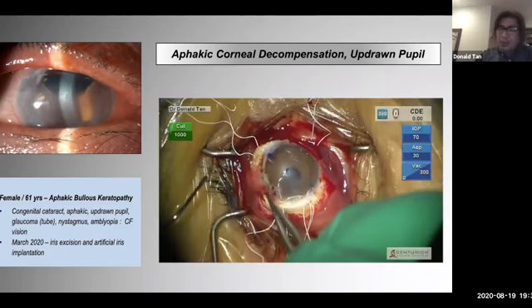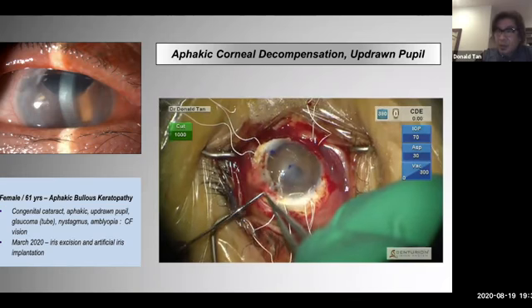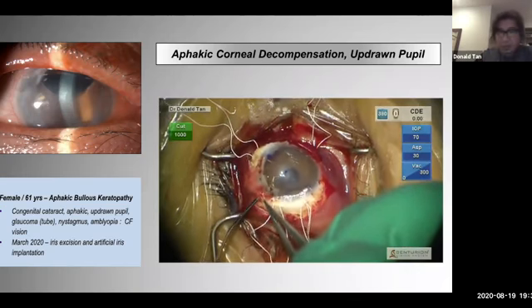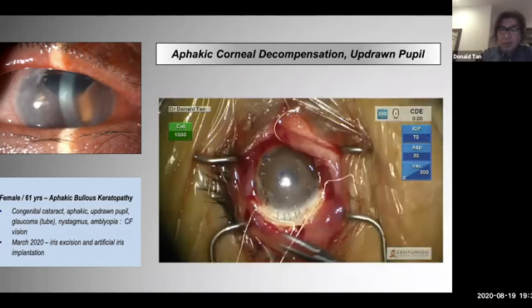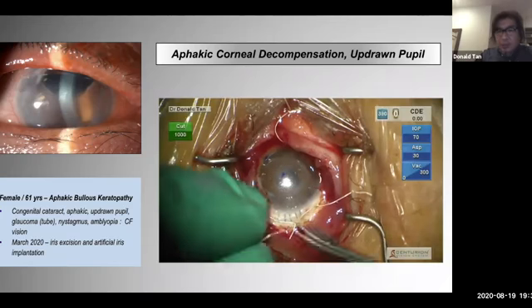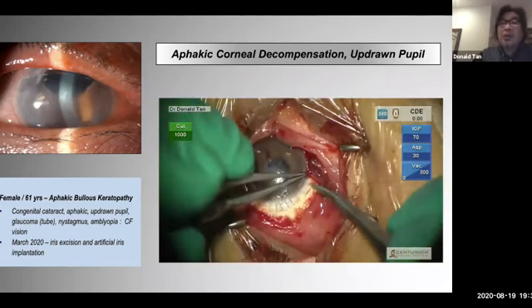All right, so this stage is under general anesthesia. It does take a long time. On average, by the time you trim the iris and everything else and do the vitrectomy, stabilize the iris, it's probably a 2-hour procedure. But just take your time and go through all of this, and basically you're trying to normalize the AC.